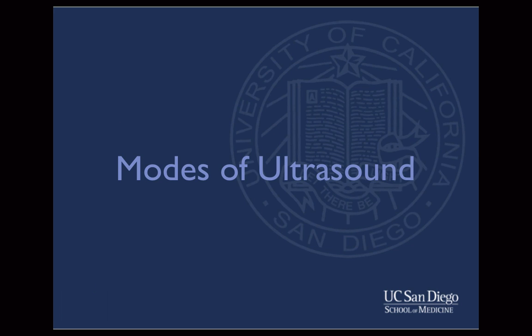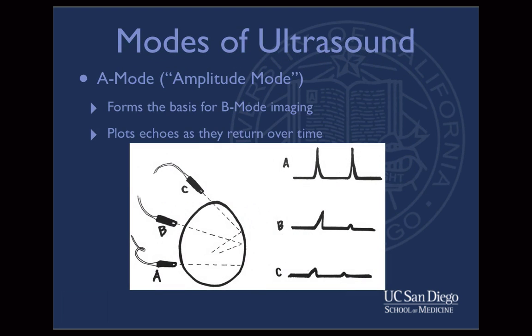We will now discuss various modes of ultrasound scanning. A mode is the basic mode of ultrasound, which refers to the plotting of echoes as they return over time. This mode is now quite uncommonly used in modern medical sonography. Understanding the details of this mode is not necessary for the scope of our ultrasound course. However, it should be noted that the A mode forms the basis for B mode imaging.